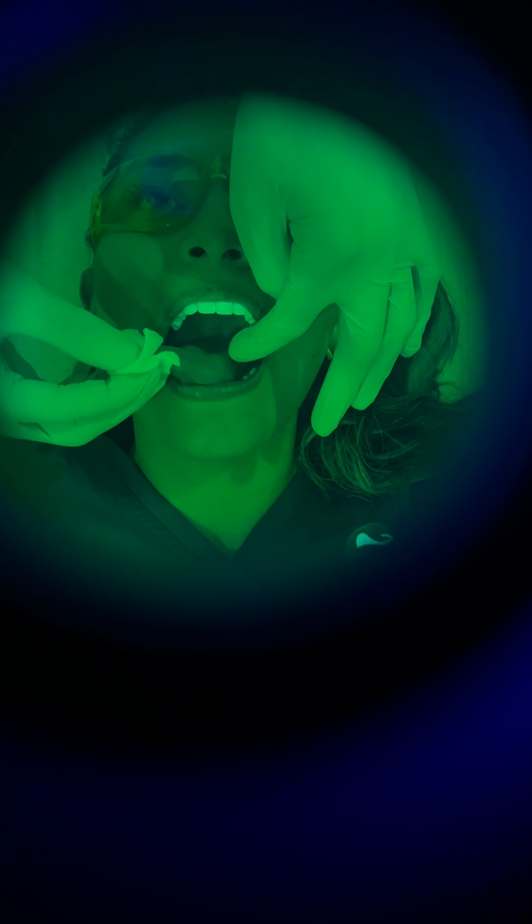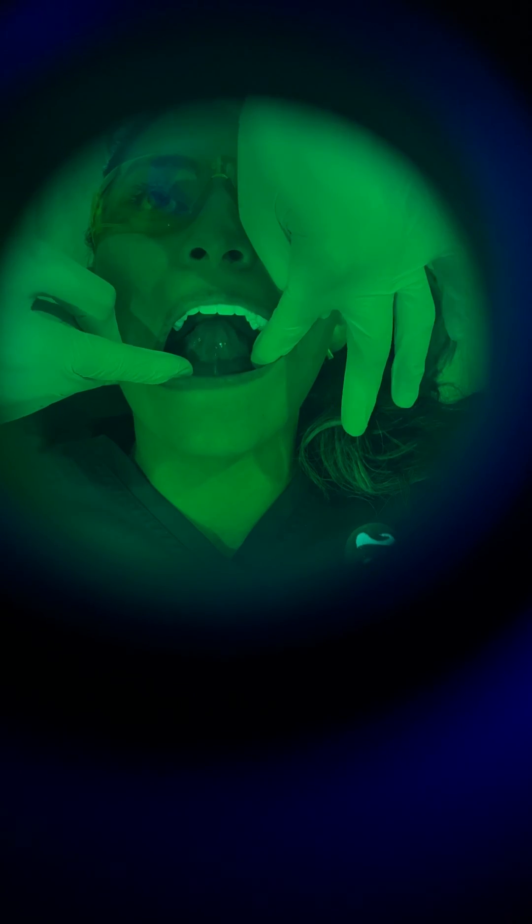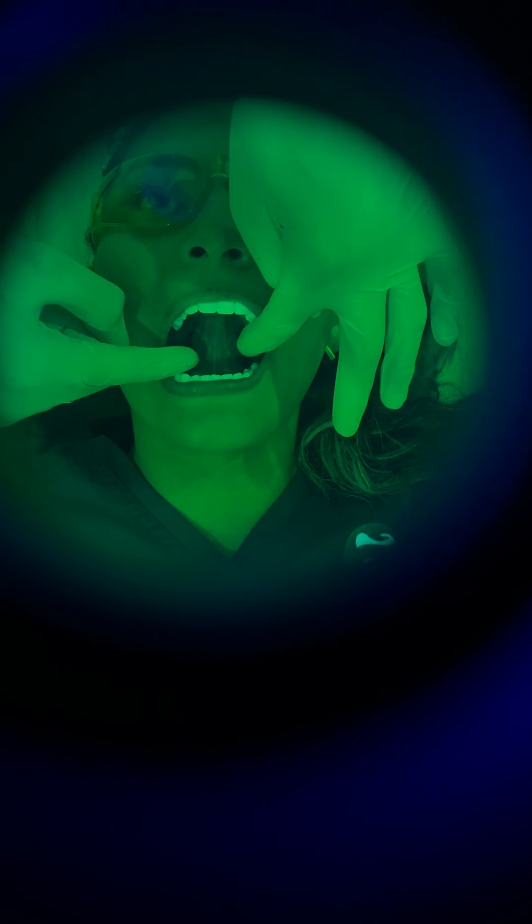We're now going to check the underside of the tongue. We ask the patient to stick out her tongue to the top of the palate. Everything looks clear right there, too. So now we're done with the soft palate, the hard palate, the lateral borders of the tongue, and the underside of the tongue.